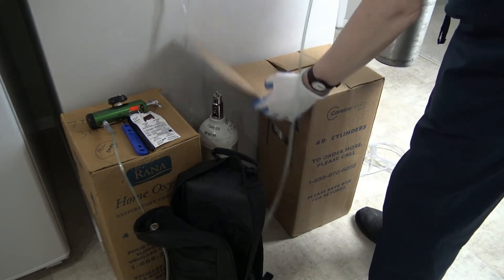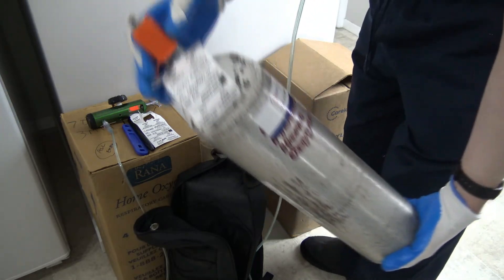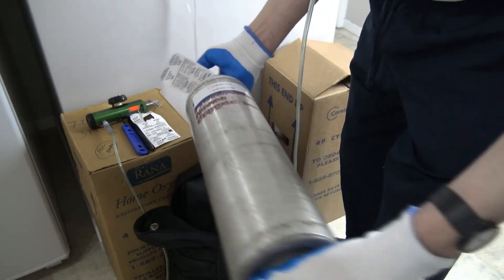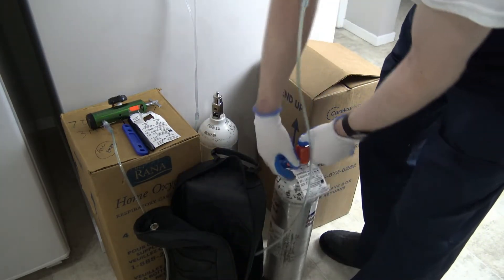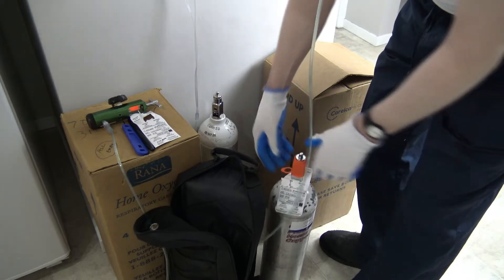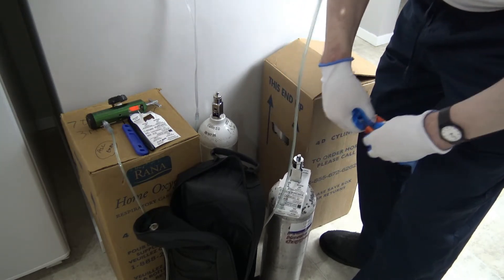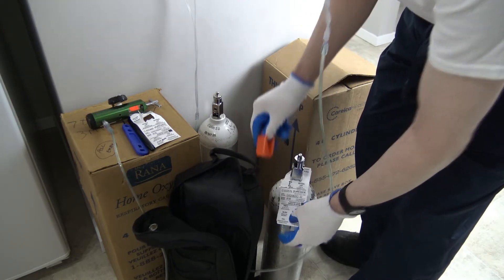So this is what a new cylinder looks like here — brand new cylinder, all ready to go. That's all you do. Pull this off. Keep the label on there because the label has 'empty,' 'in use,' and 'full.' Right now this one is full.